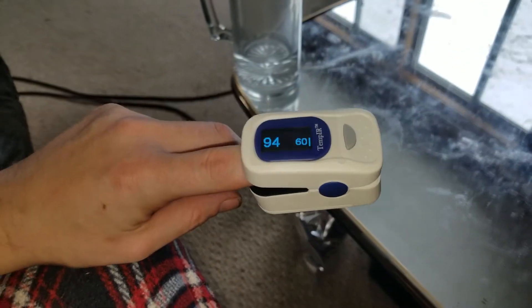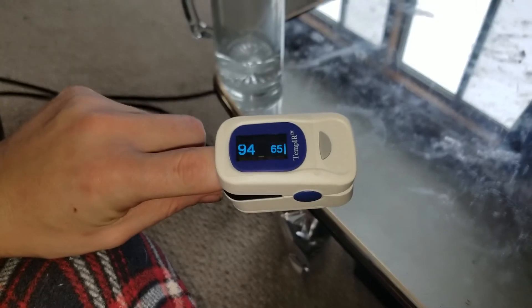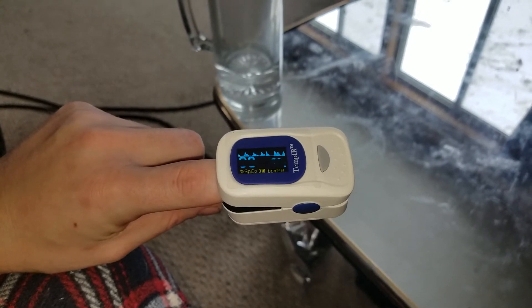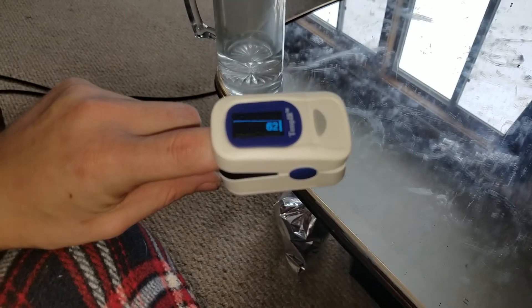Hello everybody out there in YouTube land. I'm going to show you the TempIR Pulse Oximeter. That's what it is.